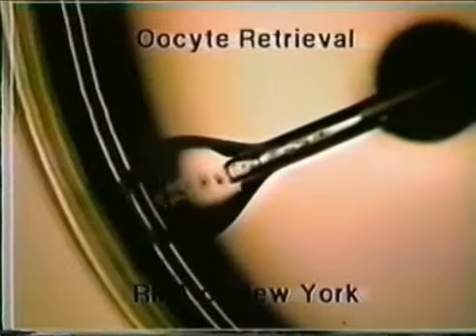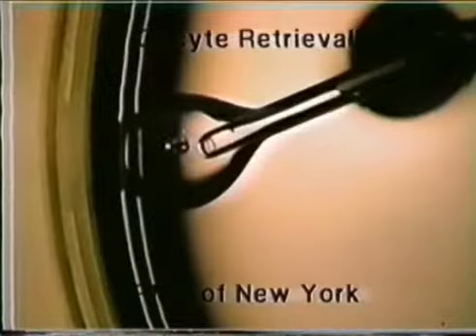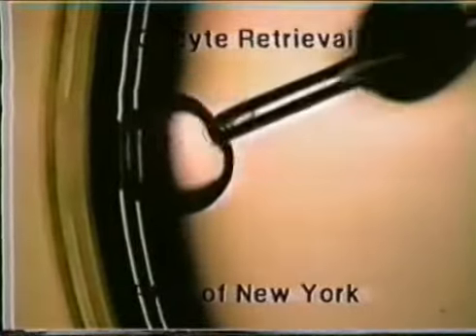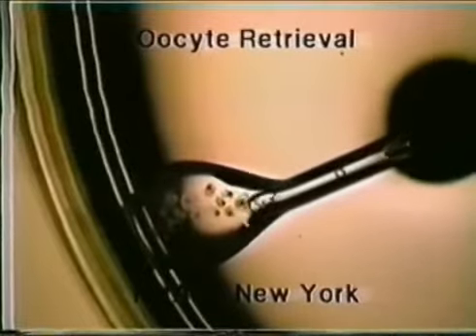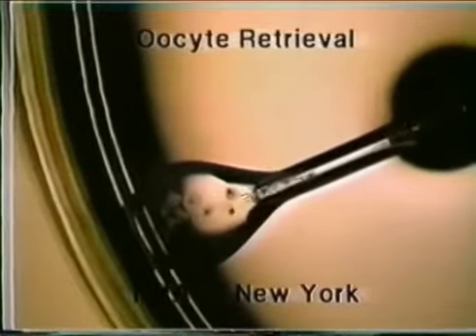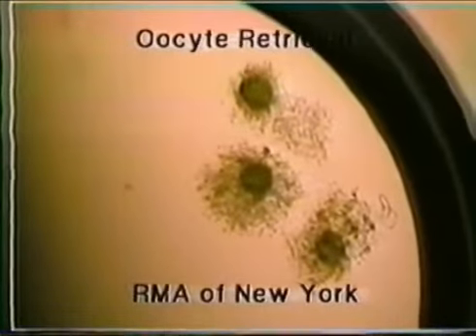Once all dishes have been witnessed by 2 embryologists, the eggs are moved from a temporary retrieval dish into a culture dish where a few eggs will be cultured together in each media drop. At the conclusion of the retrieval procedure, the final number of eggs retrieved is recorded and the dish is returned to the incubator where it will remain until the time of insemination.